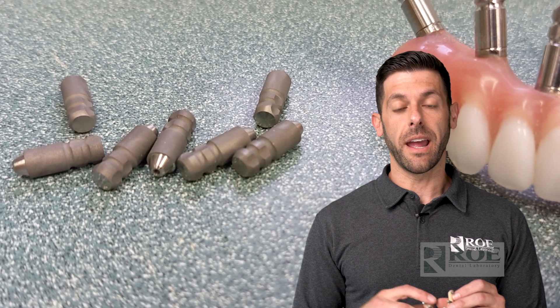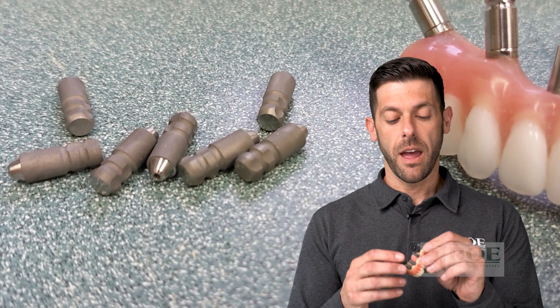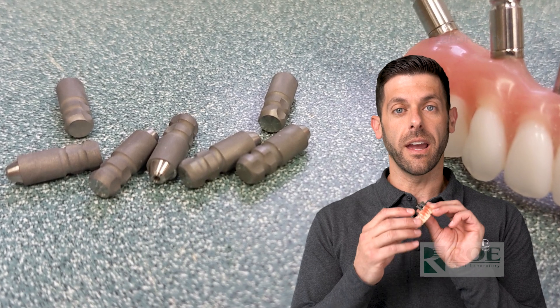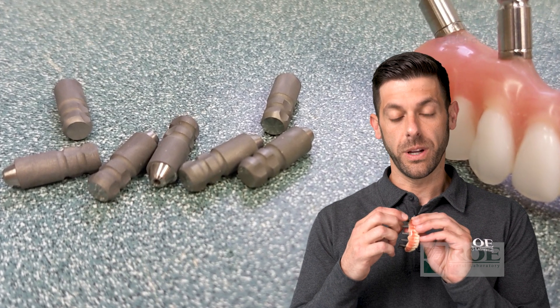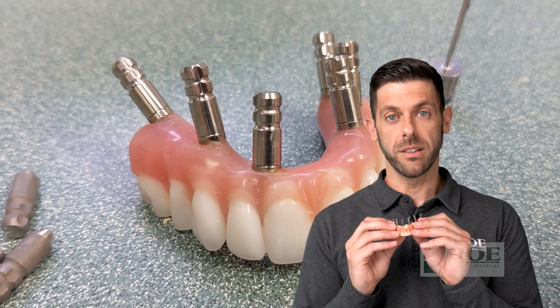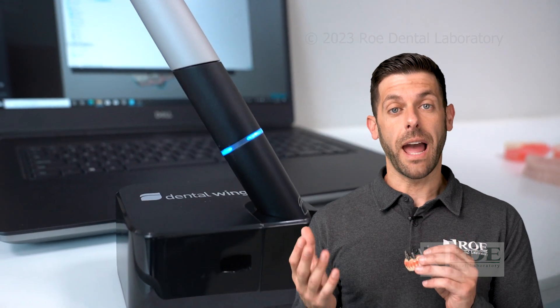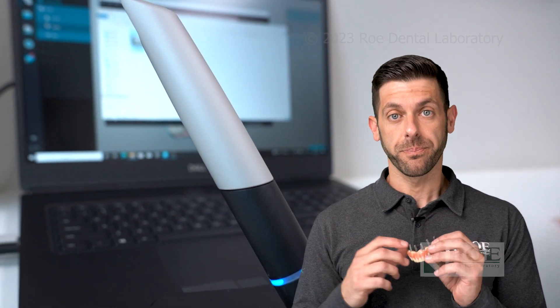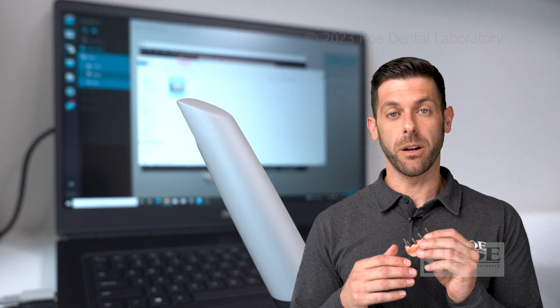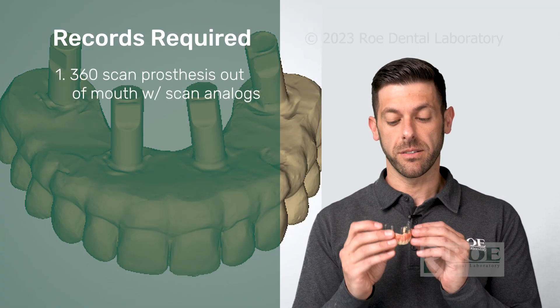We're going to have a series of scans. For the first scan, you're going to unscrew the patient's prosthesis. We send you these scan analogs, and you screw each one into the prosthesis. Then you're going to take your intraoral scanner — or a lab desktop scanner will work as well — and do a 360-degree scan of the prosthesis.